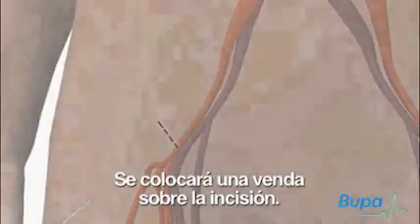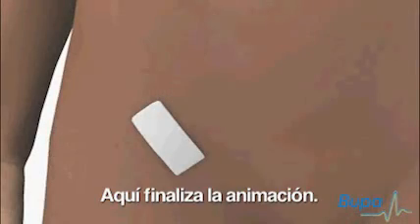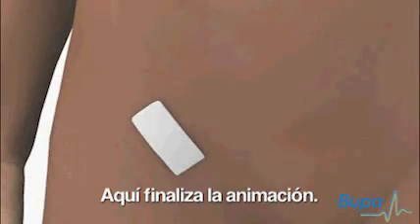A dressing will be placed over the incision. This is the end of the animation.